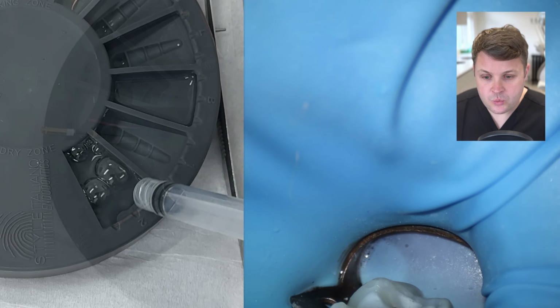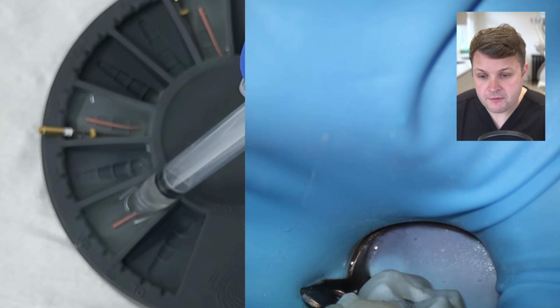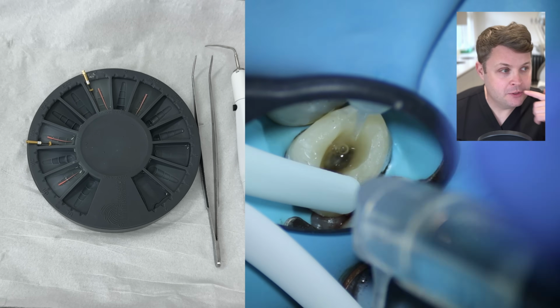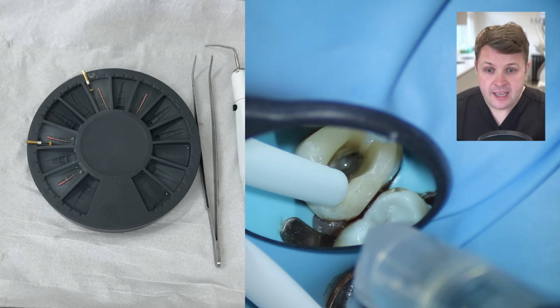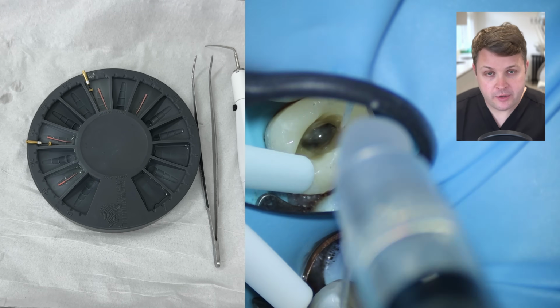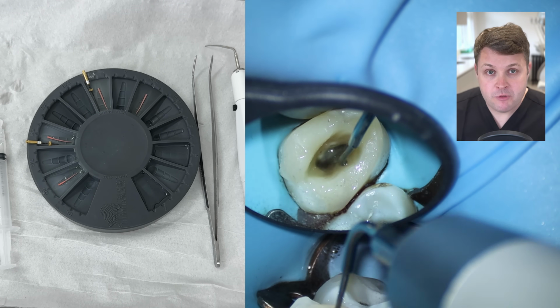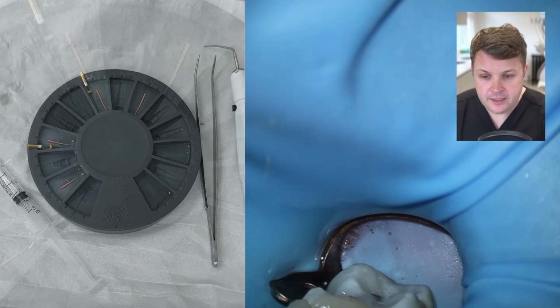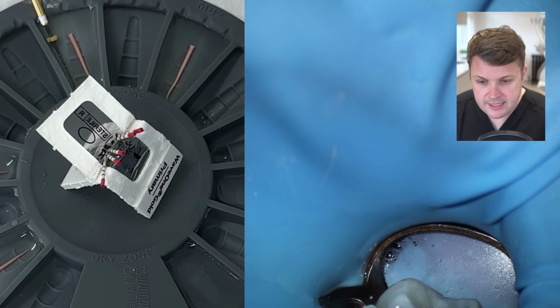We're then going to use our final rinse of 5% sodium hypochlorite. What you'll notice is you'll use the sodium hypochlorite first, that will run clear. You'll then use the EDTA, and then you'll go back in with the sodium hypochlorite. Because the smear layer has been removed, it'll start to not run clear again. So it's very satisfying that you know you're cleaning the canal orifices really nicely.